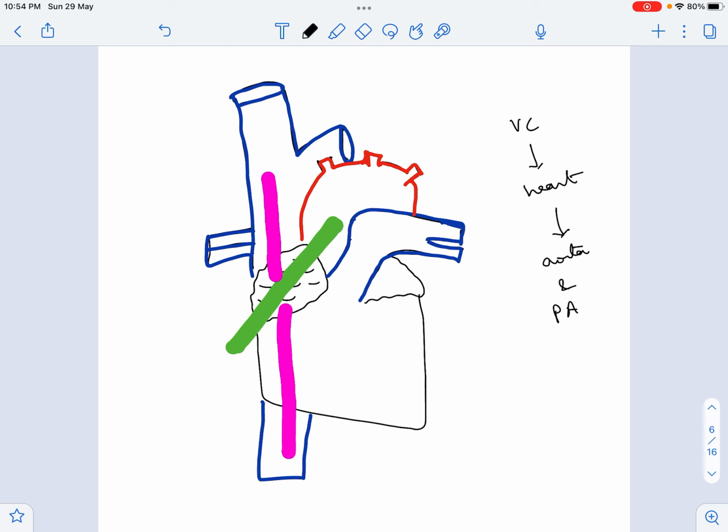Now, we have cannulated the aorta first. So, we have taken control over blood that is flowing out of the heart, and we have also taken care of the vena cava in venous cannulation. So, we have taken control over blood that is entering the heart. Now, the heart is still beating, mind you, and the heart also contains blood, because we have not yet emptied the heart. So, the heart contains blood, and we have not yet taken control of the heart beating.